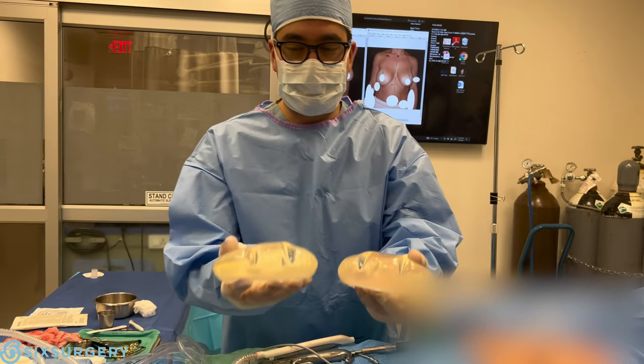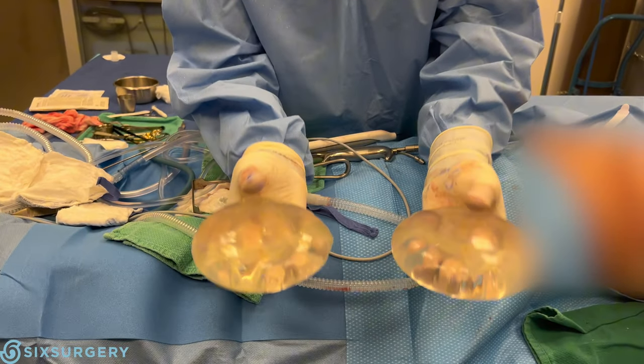So implants are up. You guys want to see? It looks like this. These are from 1997.